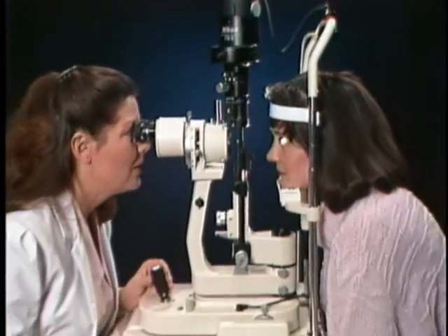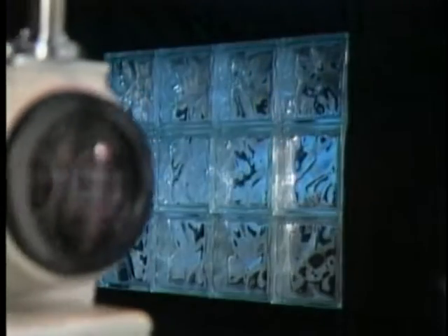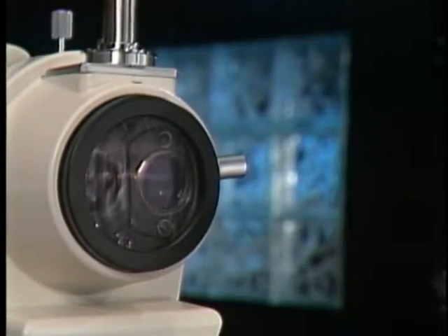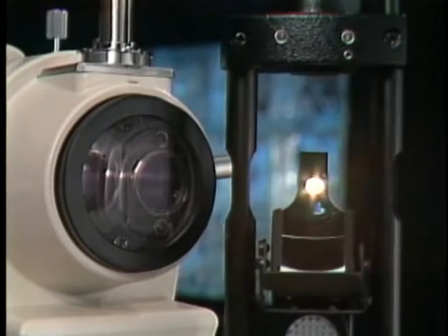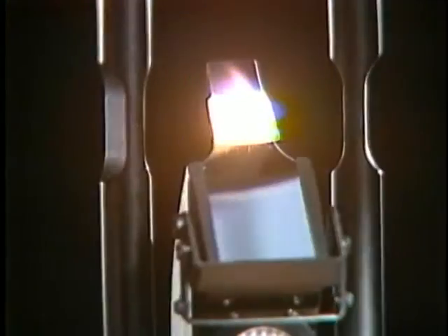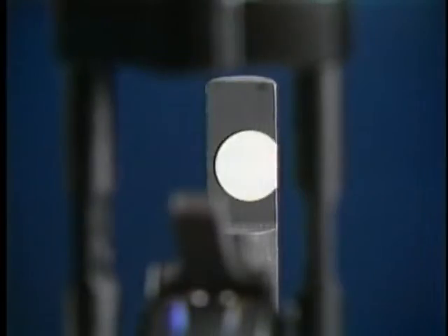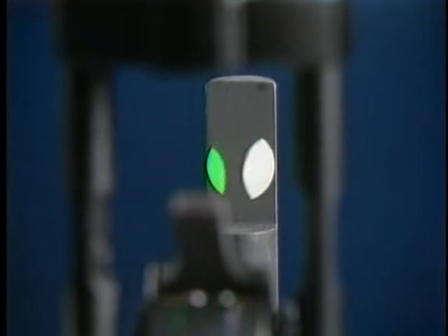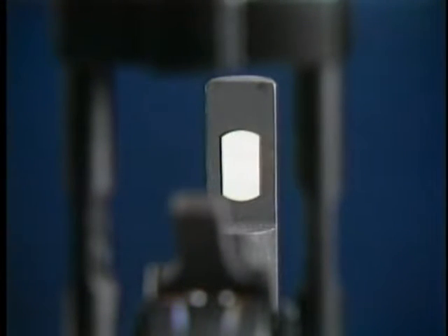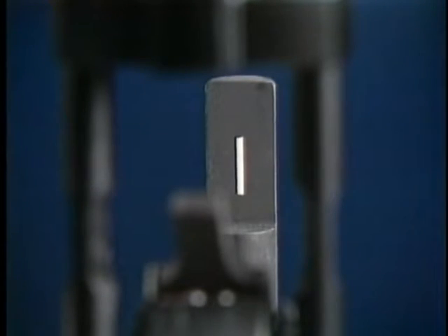All modern slit lamps share similarities in design. They have two basic components: a microscope and an illumination system. The illumination system provides a precise and adjustable source of light. It consists of a rotating mirror, a variety of filters, and controls for varying the width, height, and rotation of a slit beam.